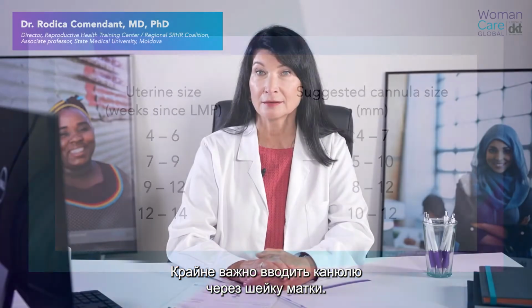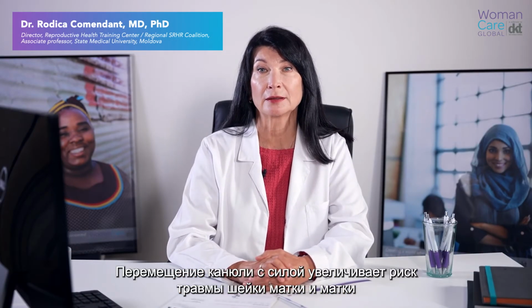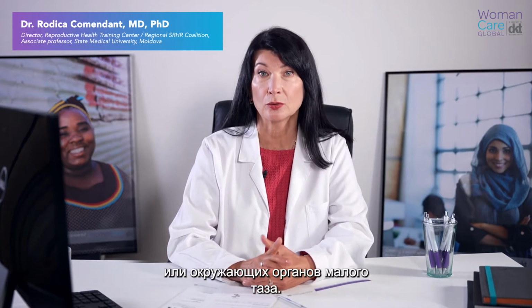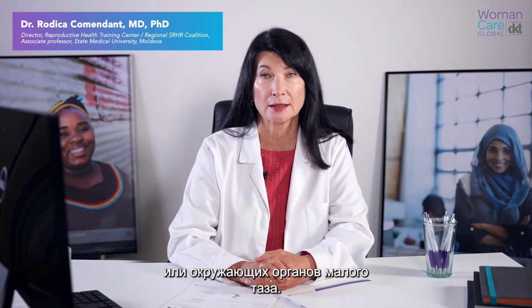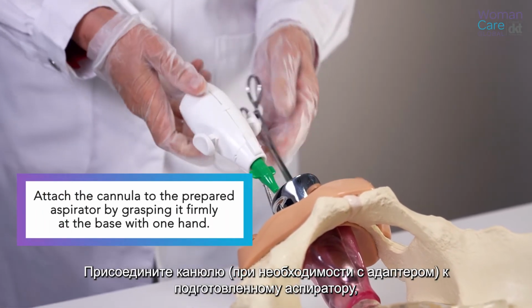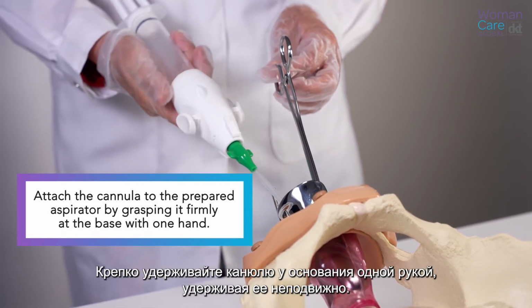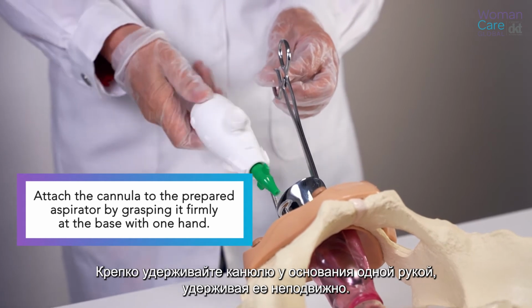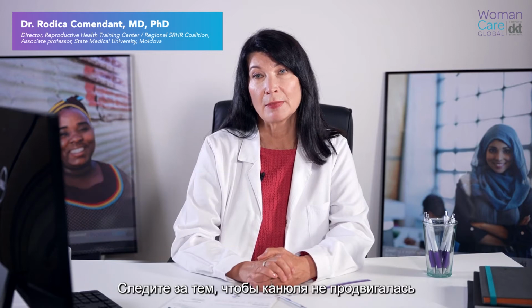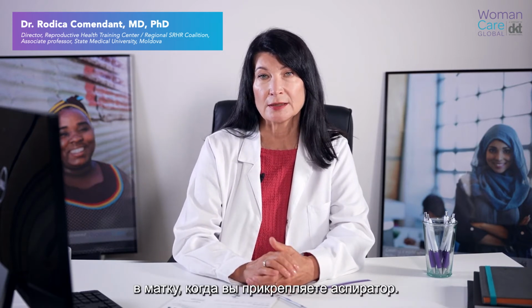It is critical to insert the cannula gently through the cervix. A forceful movement of the cannula increases the risk of trauma of the cervix and the uterus or the surrounding pelvic organs. Attach the cannula with the adapter, if required, to the prepared aspirator, which has the vacuum already established. Do this by grasping the cannula firmly at the base with one hand, holding it steady. Make sure that the cannula does not move forward into the uterus as you attach the aspirator.